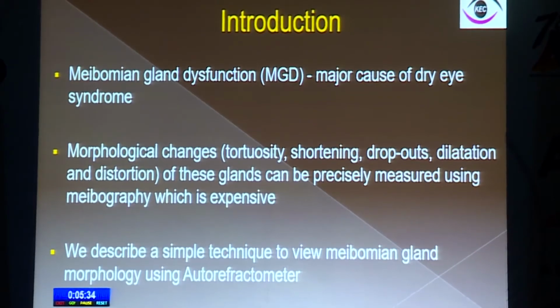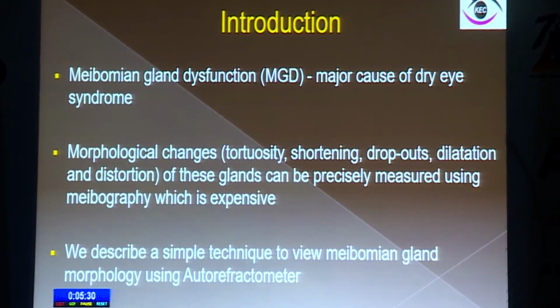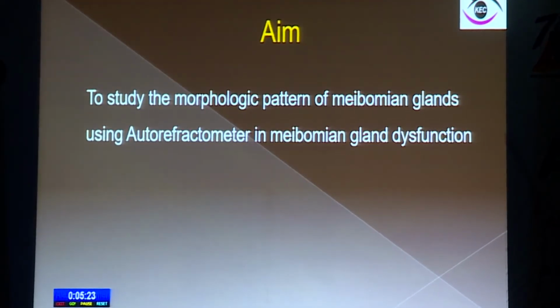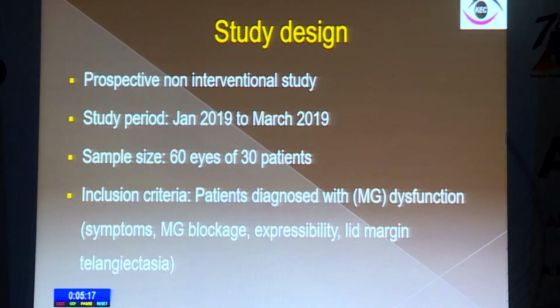We describe here a very simple technique which every practicing ophthalmologist can apply in day-to-day practice to view the meibomian gland morphology using a simple autorefractometer. So the aim of the study is to study the morphological pattern of the meibomian glands using autorefractometer.